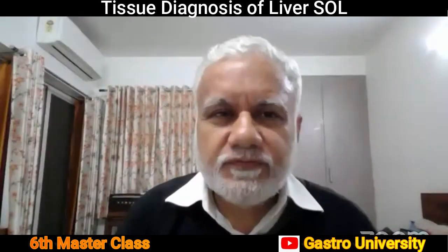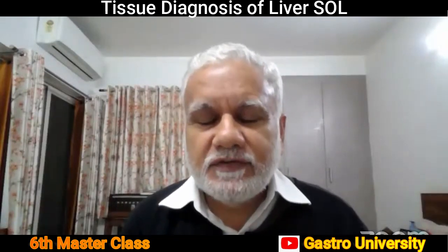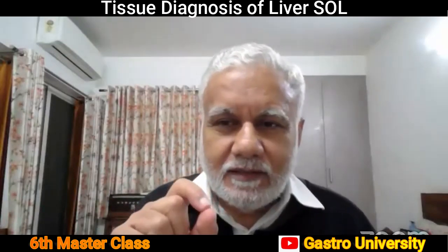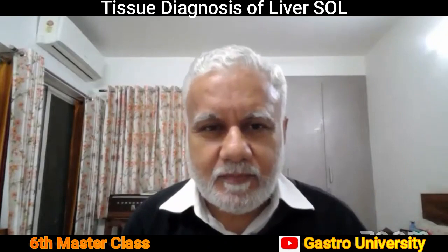So this new technique of cell block, because many a time intraoperatively, we the surgeons ourselves take an FNAC. But to prepare a cell block, we will have to seek your help, isn't it?